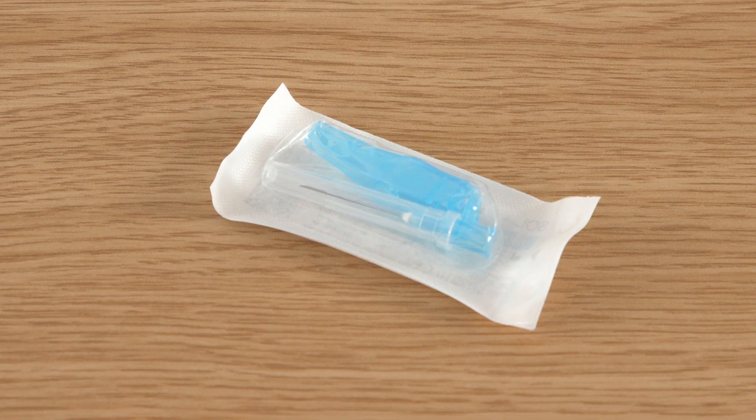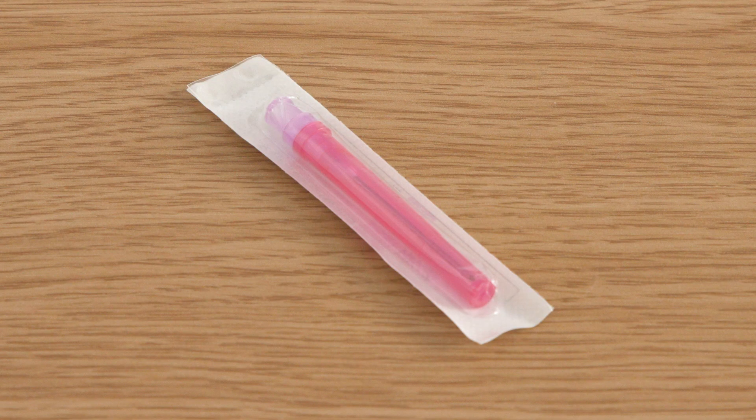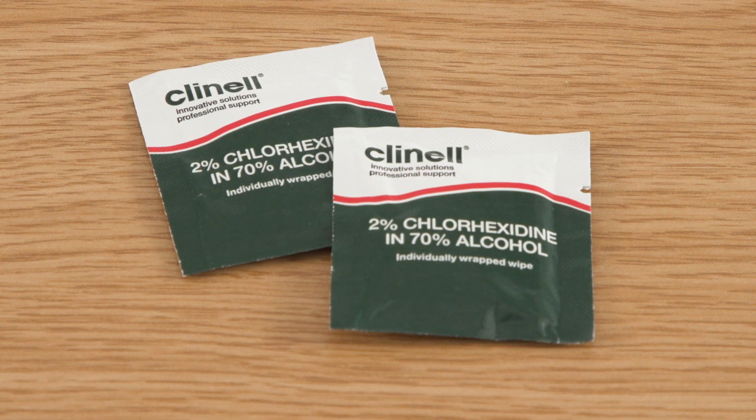I also have a blue 23 gauge hypodermic safety needle. An alternative would be a blunt filter needle, which can be recognised by the red plastic sheath and the pink needle hub. I have wipes containing 2% chlorhexidine and 70% isopropyl alcohol. It is fundamental that I use these as this is the most effective solution at getting rid of any extrinsic microorganisms that might lead to bloodstream infection. I will need one to decontaminate the ampoule of 0.9% sodium chloride and one for decontaminating the needle-free access device later.